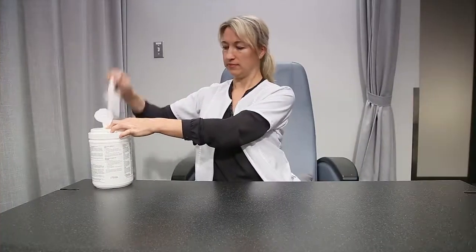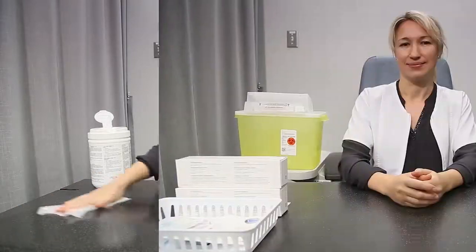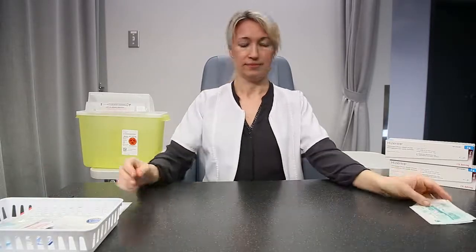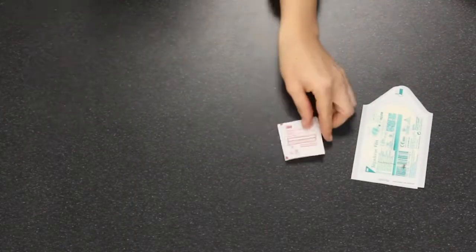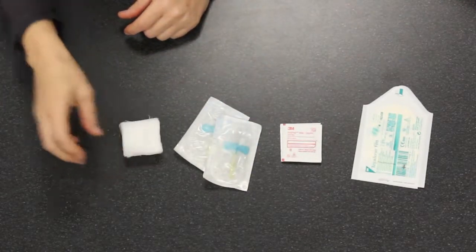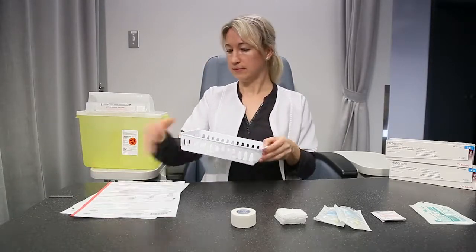Wash your hands and your work area. Gather all the necessary supplies. You will need your prescribed dose of immunoglobulins in pre-filled syringes, medical tape or adhesive dressing, antiseptic swabs, a butterfly needle with tubing, gauze sterile or not, medical tape, your treatment registry, and a biohazard container.